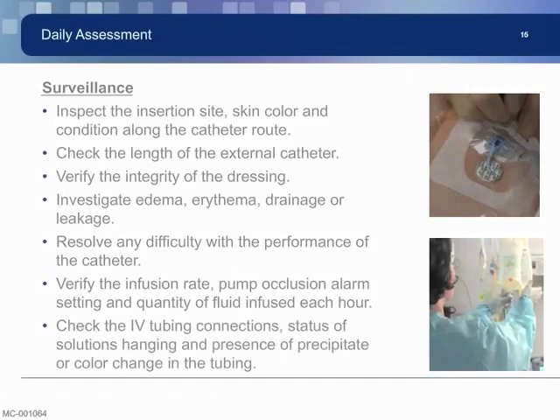Once a central venous catheter has been inserted, regardless of the insertion area, daily maintenance and line assessment should be performed. Catheter dwell time can be directly associated with infection risk. Therefore, diligent surveillance processes should be followed to promptly remove unnecessary central lines.